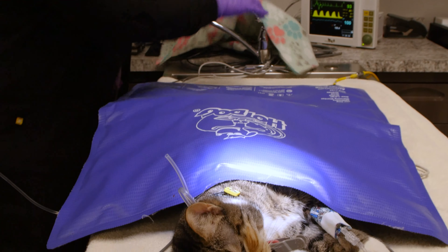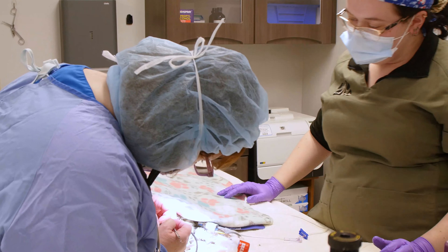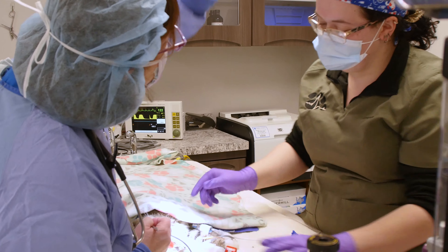To ensure that your pet stays warm during this procedure, we use a thermoregulation unit. A veterinary nurse will be right beside your pet monitoring vitals during the procedure and recovery.